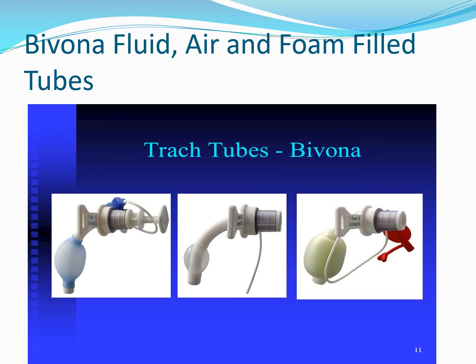Another manufacturer is Bivona. Some folks think that when we talk about Bivona, they make only foam-filled cuffs. That's not true. They have ones that can be filled with fluid, in particular sterile water. They have air-filled ones and foam ones as well.